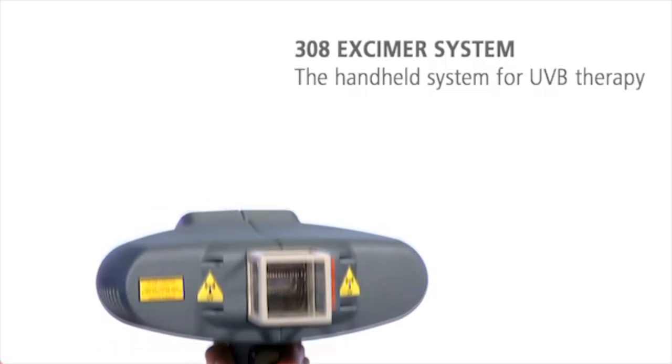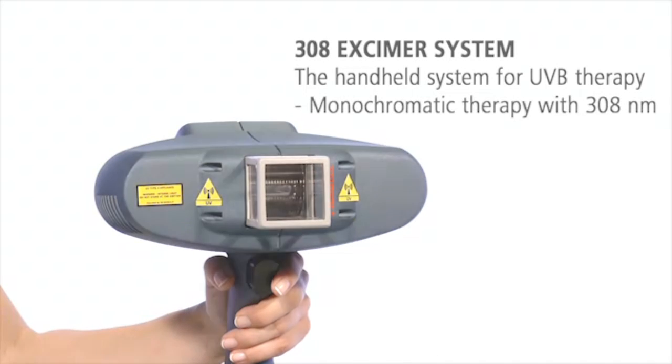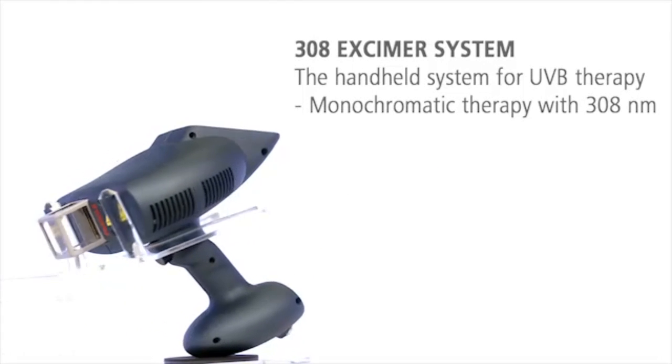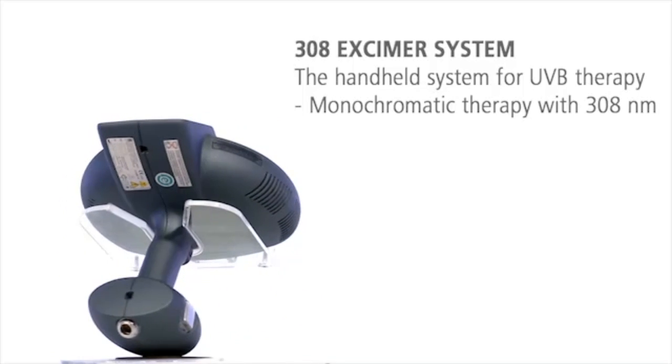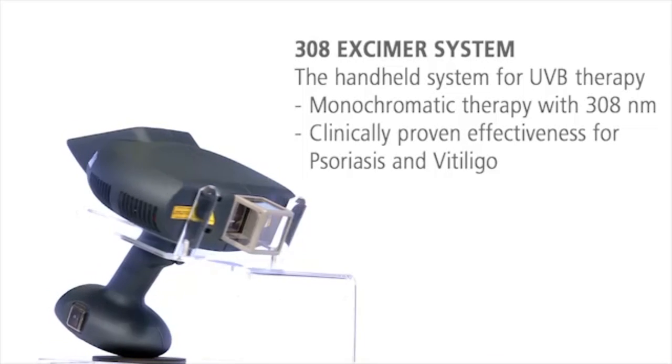The 308 Excimer System: the handy, highly effective excimer system for monochromatic UVB therapy. The revolutionary excimer technology applies the ideal wavelength of 308 nanometers. This makes the 308 Excimer System the effective and safe treatment solution for autoimmune diseases.